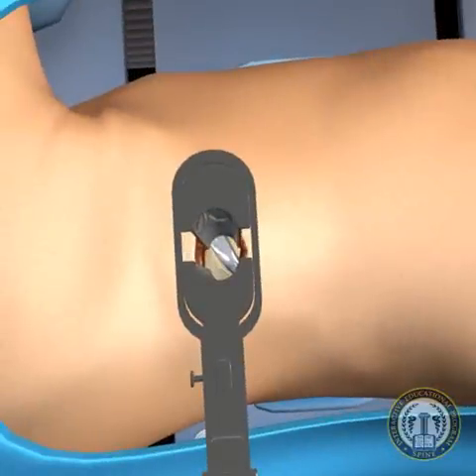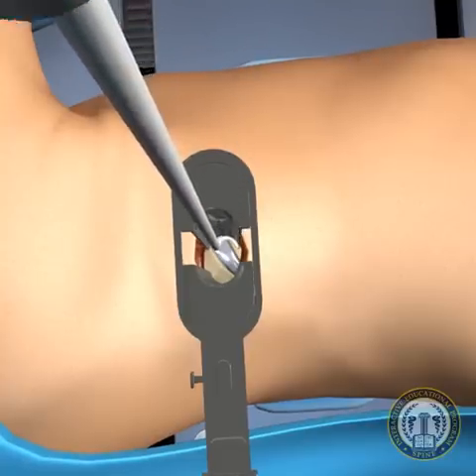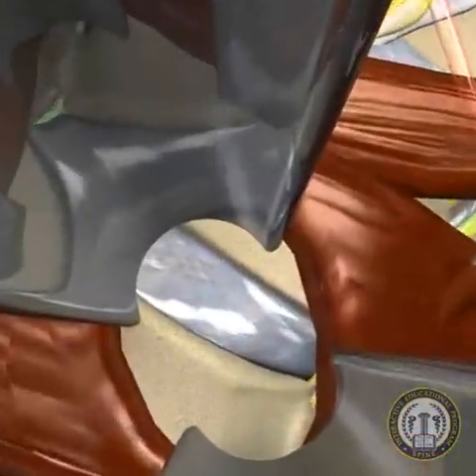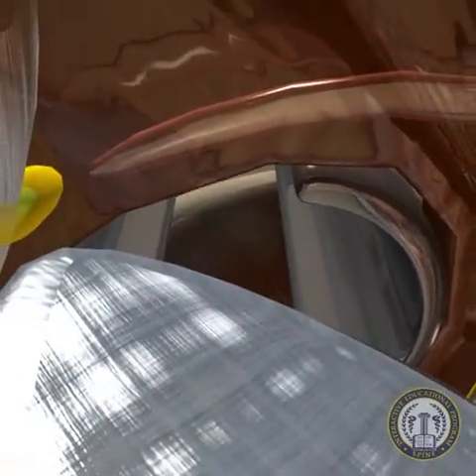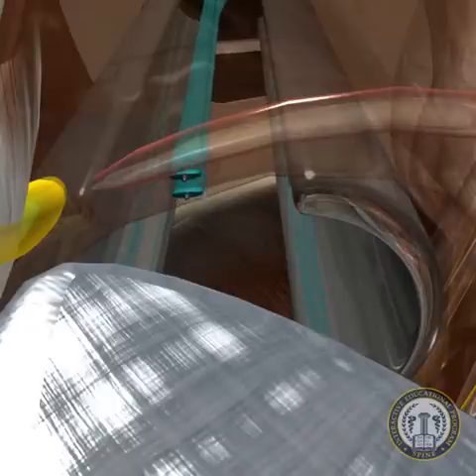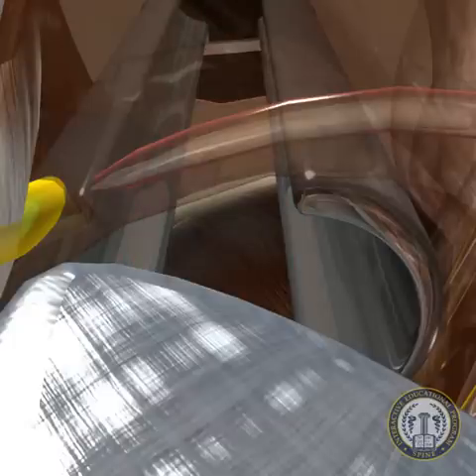Fiber-optic xenon lighting is used within the retractor and visualization is often assisted with loop magnification. With the operative corridor fully visualized, any remnant psoas muscle fibers are retracted anteriorly. Intraoperative neurological testing may be necessary to verify any stray nerve fibers that may overlie the lateral disc annulus. Bipolar cautery is used for all hemostasis for this procedure to minimize the risk of injury to adjacent nerve structures.